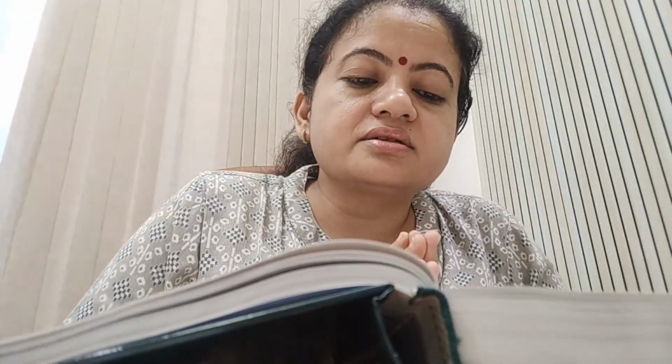Second, construct your wound very skillfully, with a very nice incision, so that there is no excessive fluid leak during surgery. If there is a sudden intraoperative shallowing of the anterior chamber with rise in IOP, think of two things. First is fluid misdirection syndrome. Second is suprachoroidal hemorrhage. So that finishes the chapter.